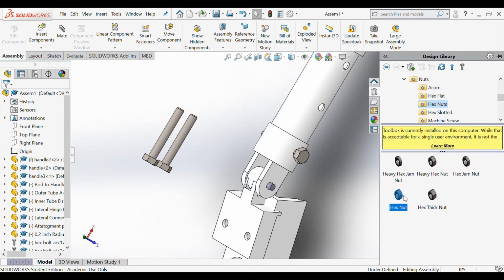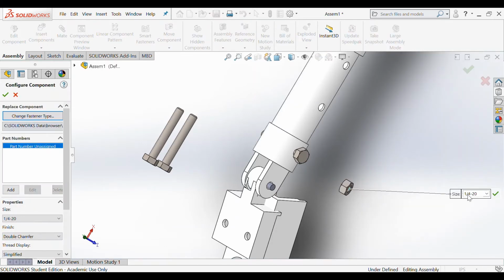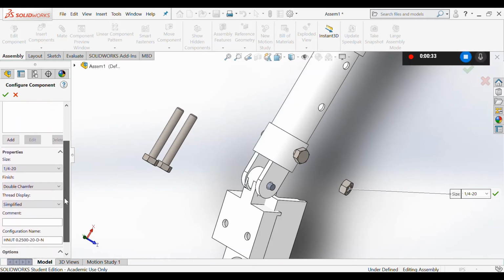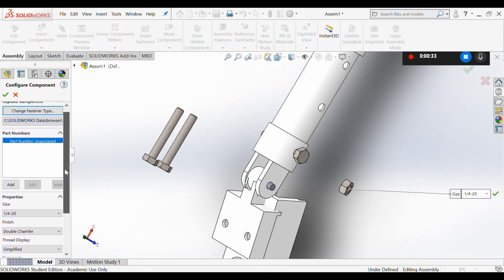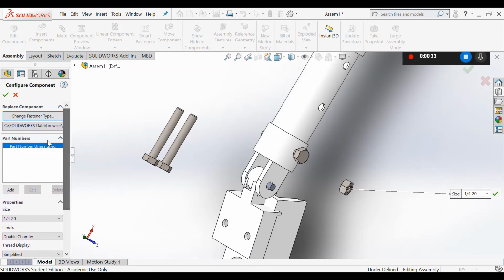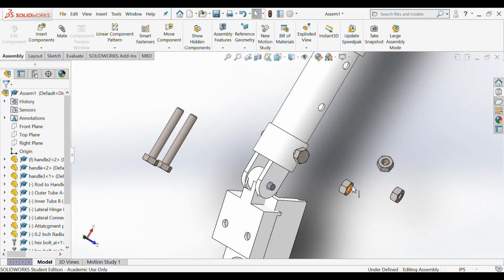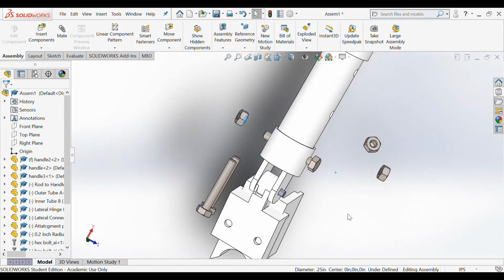You're going to go on ahead and drag that in. And then we want a 1/4-20, and go on ahead and click that check mark. Again, we're going to want 3 total. So I'm going to drag this guy over here.